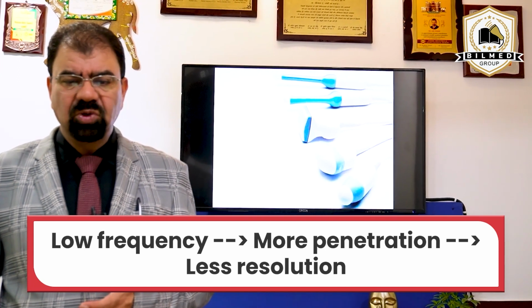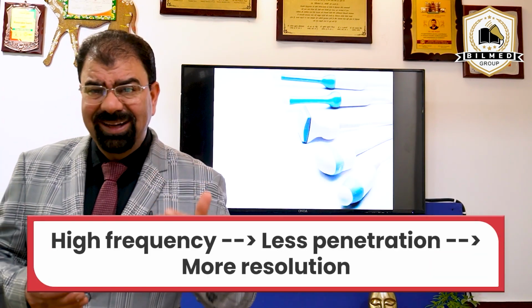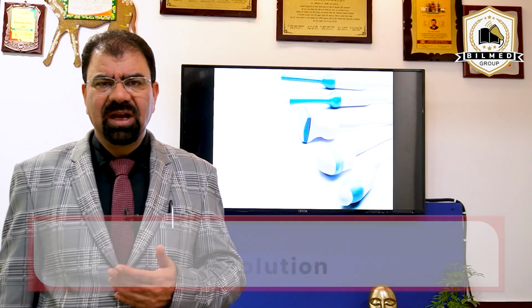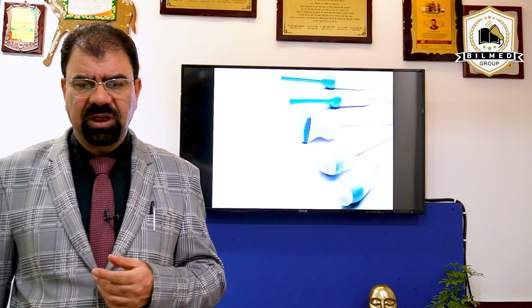But whenever I am using a high frequency probe, I am not penetrating as much, but the resolution is more. So whenever I need penetration, I will go for the convex probe. Whenever I need resolution, I have to shift to a high frequency probe.